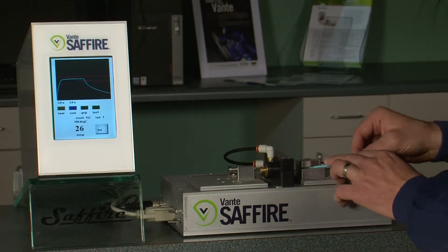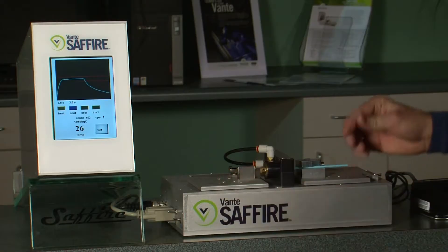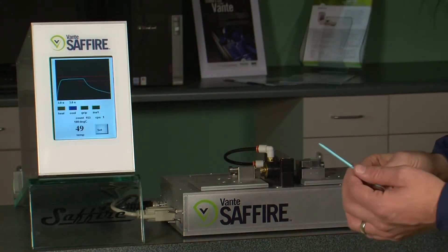To create this dilator, the operator would simply backload it onto the floating pan mandrel and hit the foot switch. It has a three second heat and a three second cool, compressed air for cooling, and the part is complete.